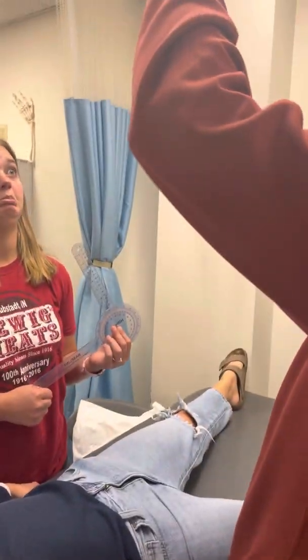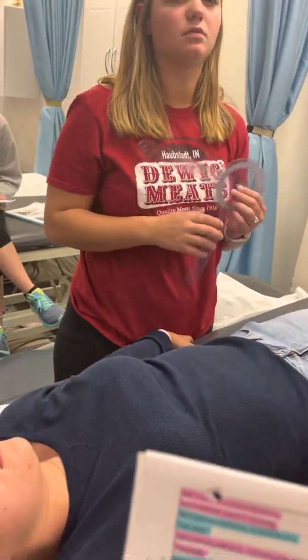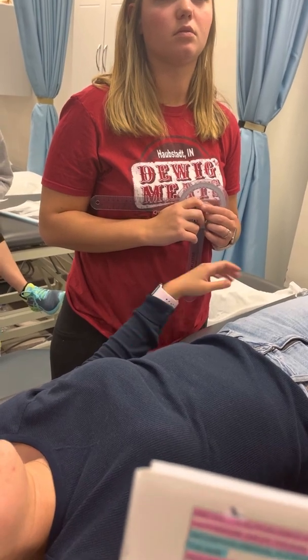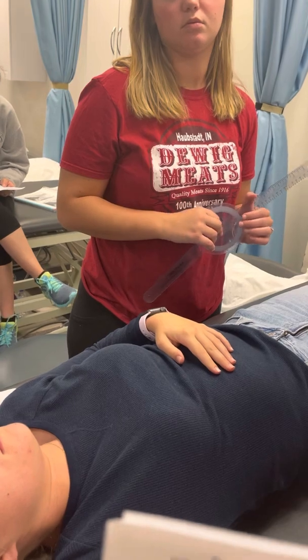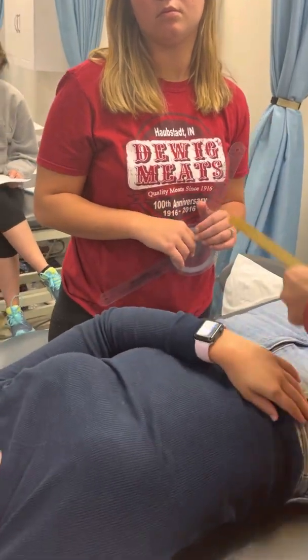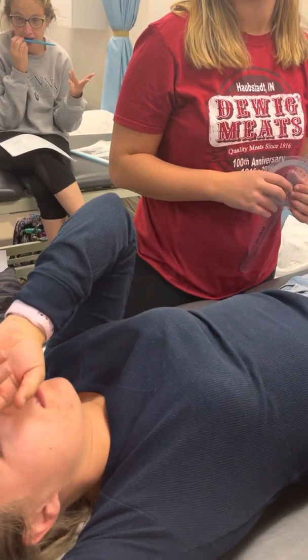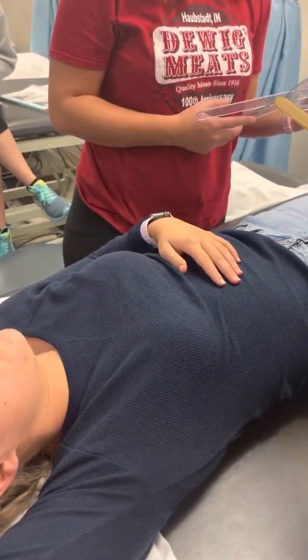So we went from 90 to 58. 90 minus 58, that's 32 degrees. That's how many degrees of abduction? 32. What's our norm? 45. So she's a little bit shy.